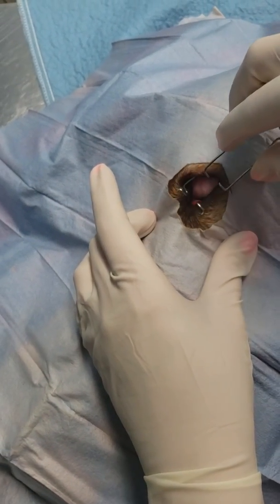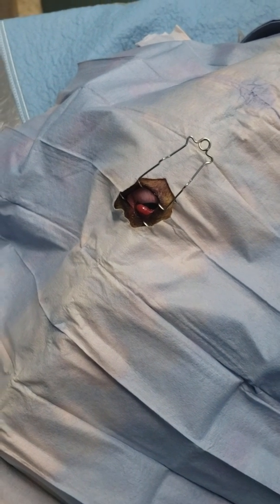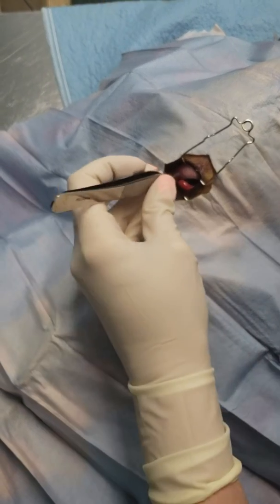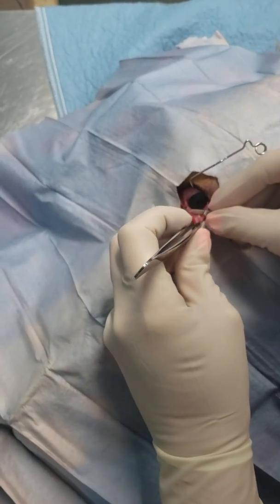We're going to show a cherry eye repair. I use 4-0 PDS for these, and it's always really helpful to have a nice pair of iris scissors as well. We're going to do a pocket technique.